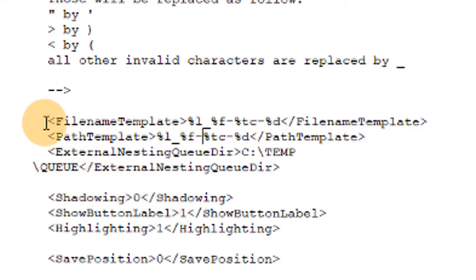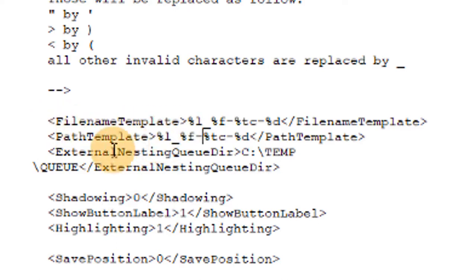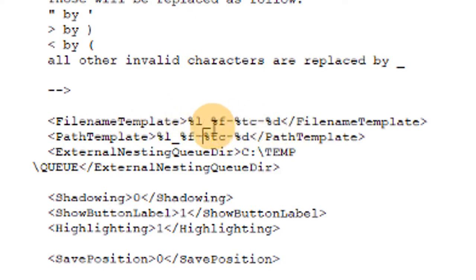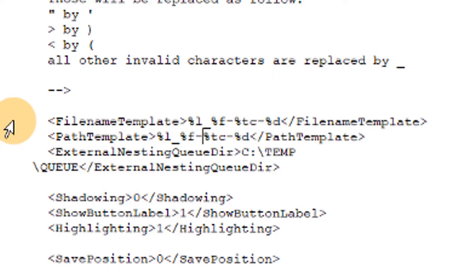And then the file name template is going to be the name of the dental CAD file within the CAD data folder, which is right below. I have those as the same naming convention of last name underscore first name dash shade dash date.